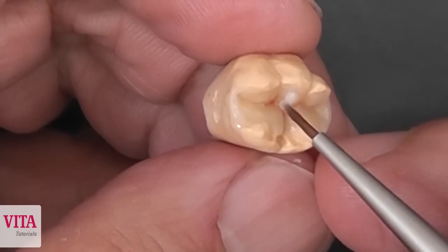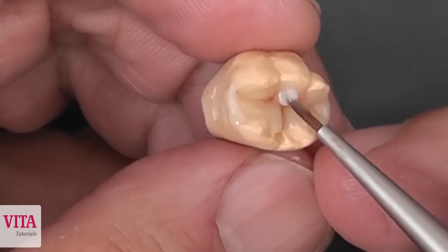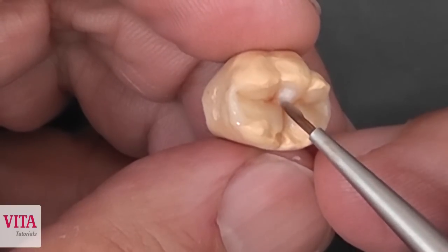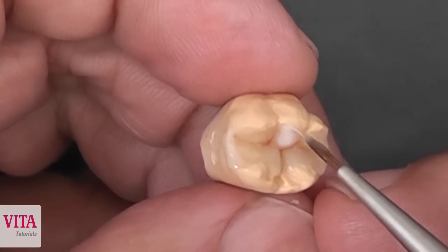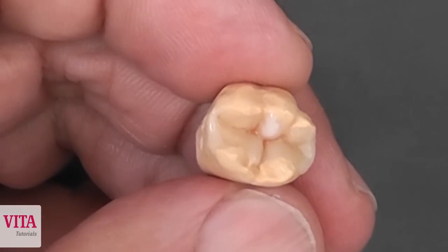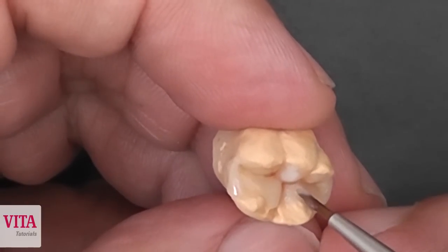Now you can see what is the big advantage of this material: it stands. You can apply it and it stands exactly where you apply it. You don't have trouble with it slumping. You can even use your brush to condense it a little bit on the model, and you can see that it always stays in the right position.